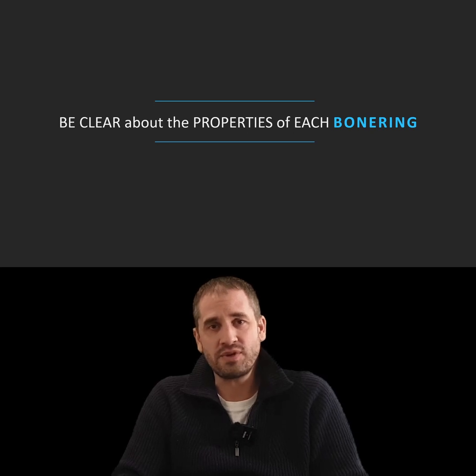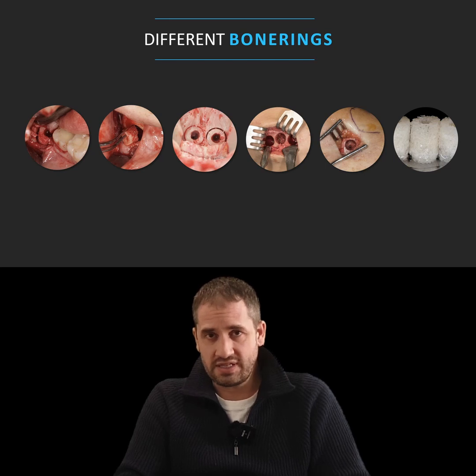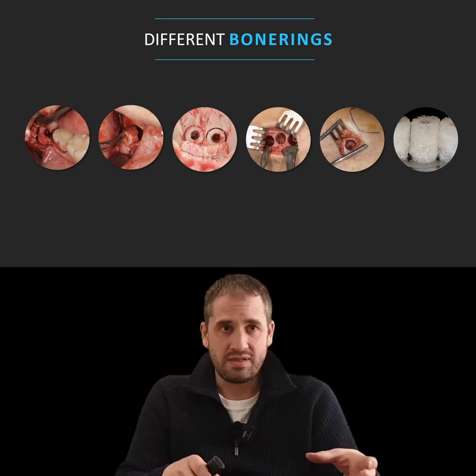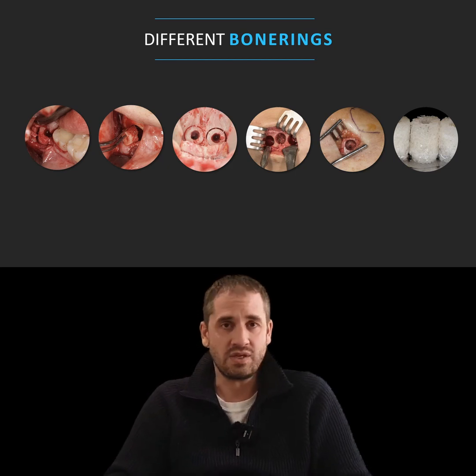Be clear about the properties of each bone ring. Here you can see six different kinds of bone rings — autogenous bone rings from different areas, and the last one, the white one, is the allograft bone ring. Everywhere out of the human skeleton you can take a bone ring. Some places make sense, some don't. The first three make sense; the other two don't, and I'll show you why.